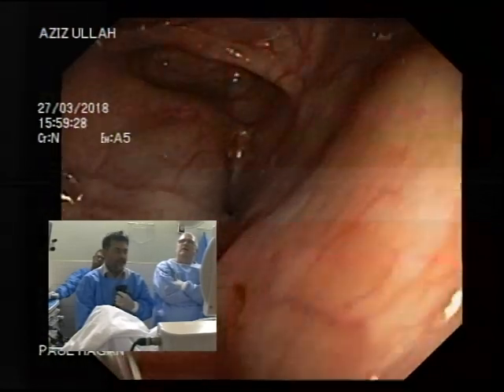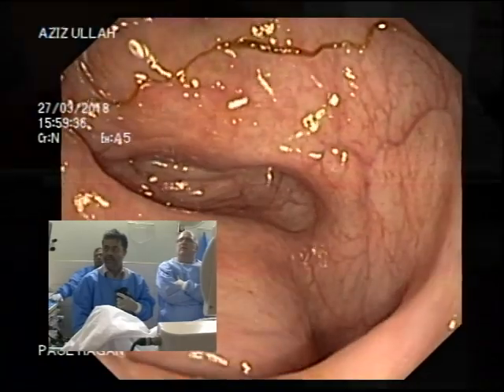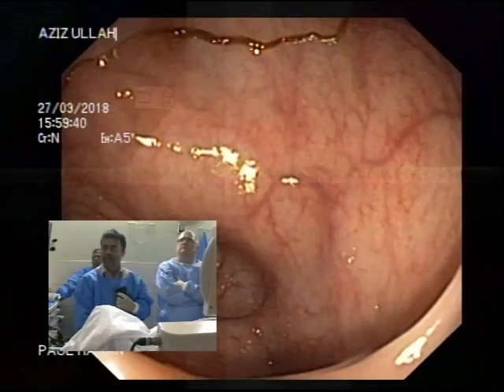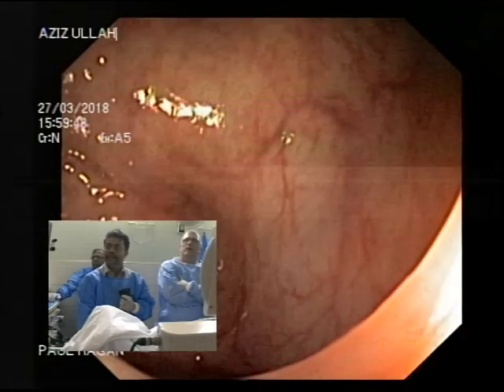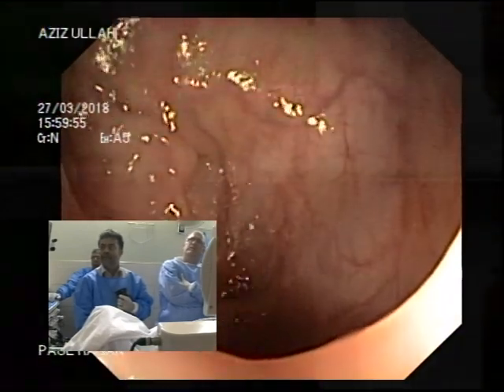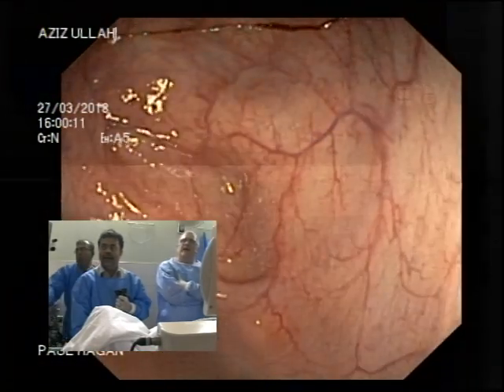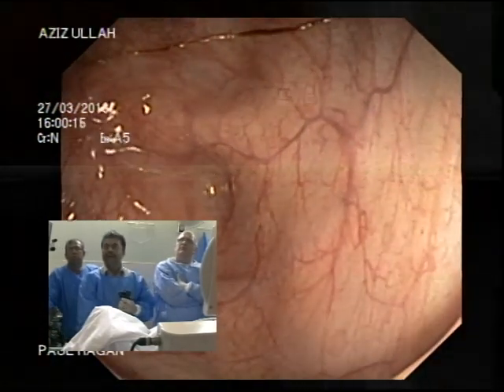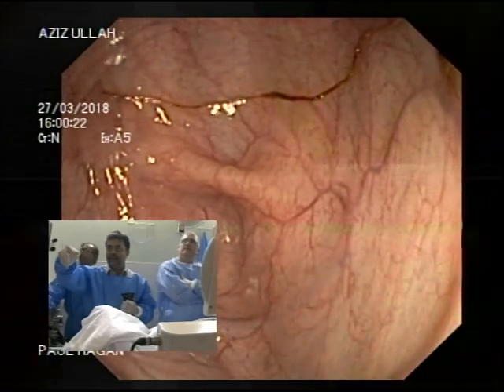Good. Good man. Look at where the lumen is. Can you see? Is it 6 or is it 10? Is it 9? Can you see? Normally I would ask you what actually made you think it was at 6. Just because I say it's at 9, what makes you think it's at 9? What about that long stringy bit of motion? Okay, keep going towards that.